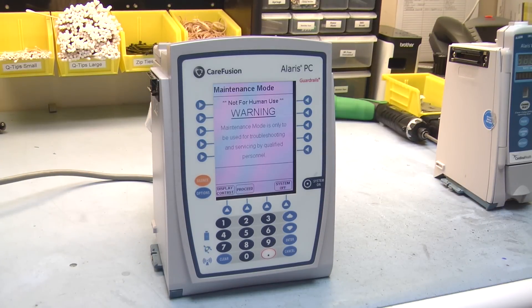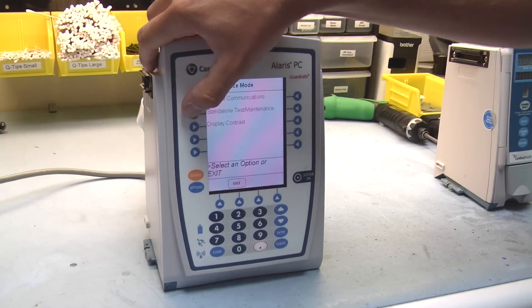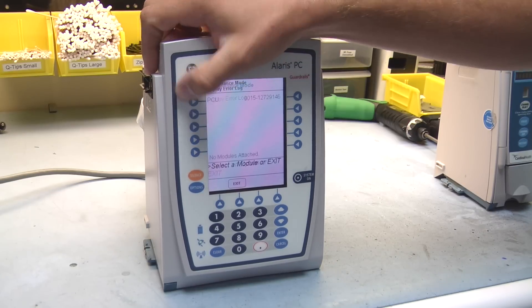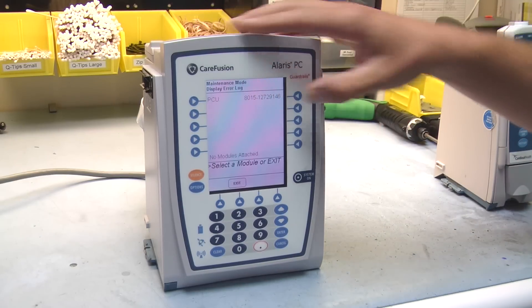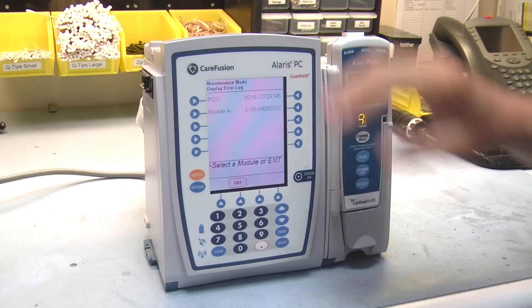You'll notice the message on the screen: it's not for human use — just making sure you're not hooked up to a patient while this is on. We'll go to proceed. In this maintenance mode, you'll be able to view when your next PM — preventive maintenance — is due. You can look at your log file maintenance and display any error logs. You'll have our PC unit here with the serial number next to it. Once we attach our 8100 module and it reads from the brain, we'll be able to view any log maintenance and any error codes that we receive.